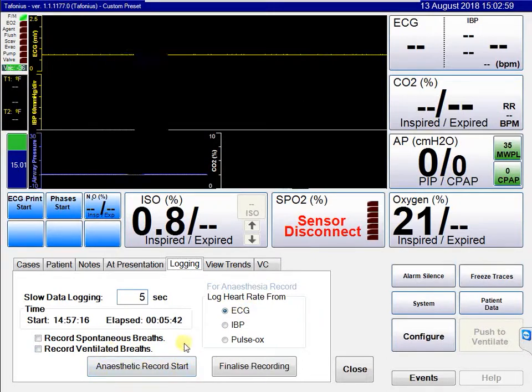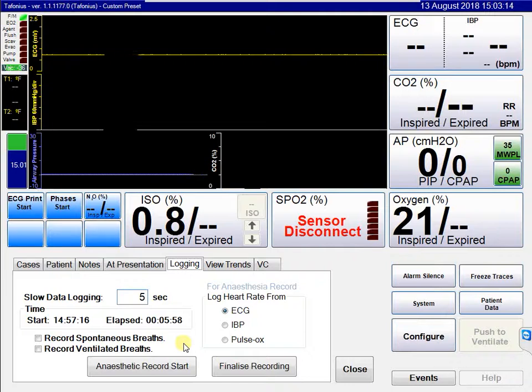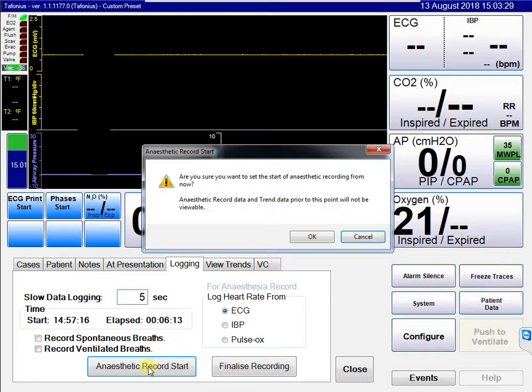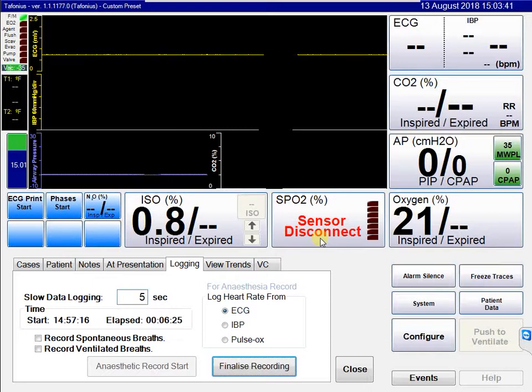There is also an anaesthetic record start button, which is important because a machine is often set up and left primed for 20 to 30 minutes before the animal arrives. As soon as the animal is connected, click anaesthetic record start. It will ask: are you sure you want to set the start of the anaesthetic recording from now? Click OK. This ensures that the 20 to 30 minutes of pre-connection data — such as noisy ECG or pulse oximetry numbers — will not be included in the anaesthetic record.